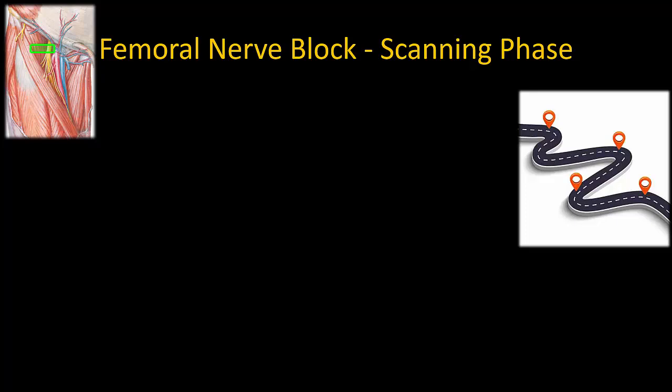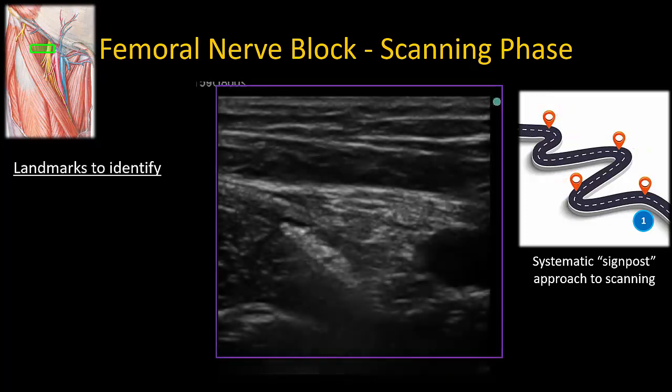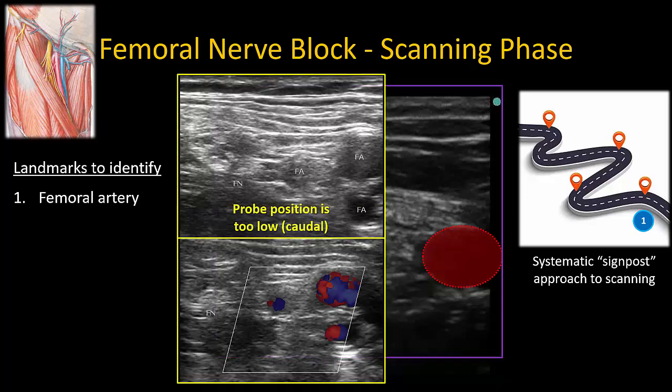The femoral nerve can always be visualized if a systematic sequence of scanning and landmark identification is used. This signpost approach is a cornerstone of my practice, as I find visualizing nerves just as hard as anyone else. The first signpost to look for is the femoral artery — search for it by sliding the probe in a lateral to medial direction and back again, looking for pulsatility. If multiple arteries are seen, it just indicates that the probe is too caudal, probably in the groin crease. Lift it out and place it more cranially, closer to the inguinal ligament.